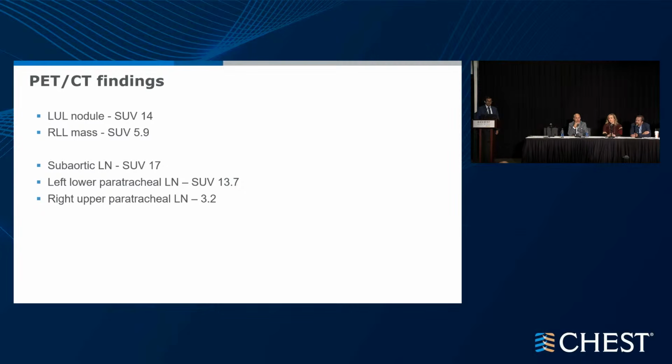So you have a cytopathologist on the room? We have a cytopathology attending, a cytopathology tech, and a cytopathology fellow. Our room is crowded, and it's not COVID proven. So we have the cytotech. Now, we can call the attending if we need to, but I'm not sure I would know with my ROSE that they were distinct.